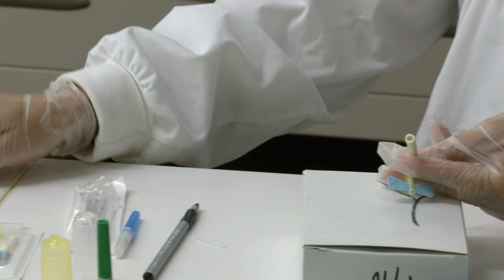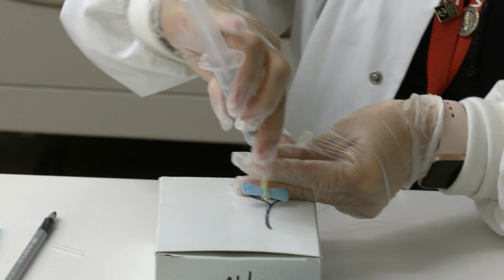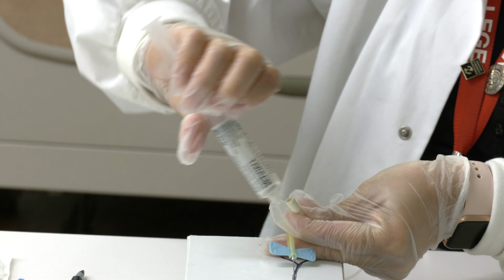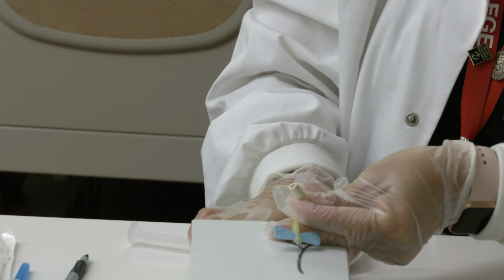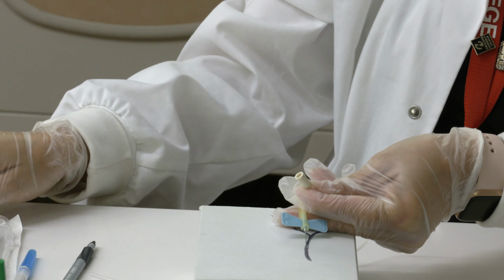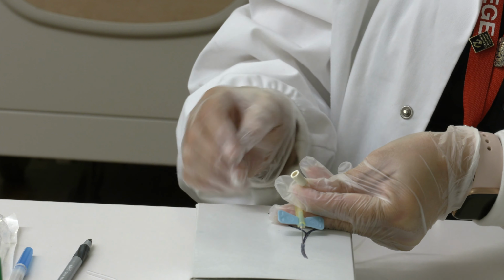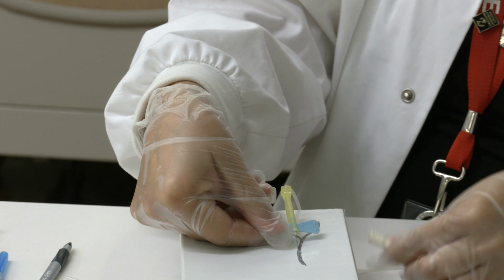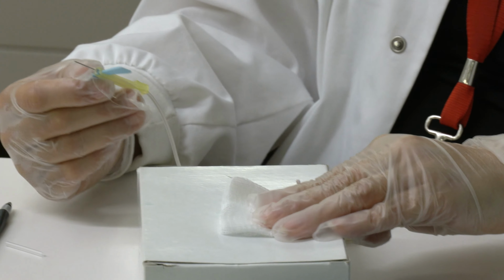draw blood. The most common way that we do it when we're using a butterfly is with a syringe. And we'll just hook it on and pull it back. And that way, when you're doing it that way, you can control how fast you're pulling blood. So you'll see it used for pediatrics when they have very small veins, or geriatrics when their veins tend to smooth down and collapse on you.